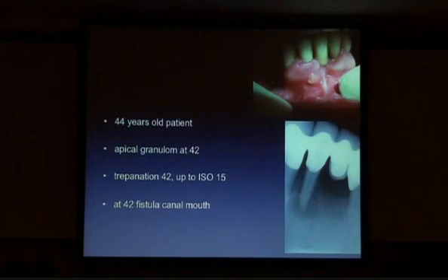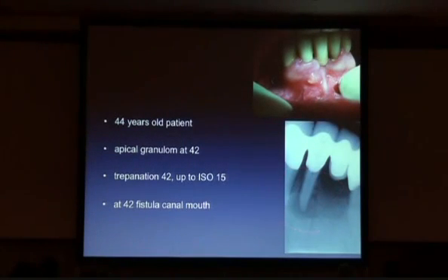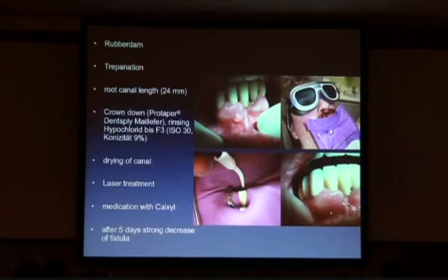And then, of course, we can be nicely confronted with cases like this, where normally a long time of pre-treatment was done in a conventional way. The patient had been referred to our university clinic because there was no solution. The resorption and the destruction was ongoing. There was even a fistula canal coming on. So we used our conventional treatment combined with the laser treatment, going with the laser into the root canals and into the fistula canals.